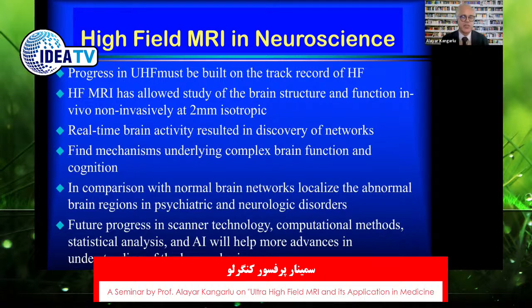For your question regarding multiple sclerosis, as you go to higher resolution, and you saw those cortical gray matter lesions, they have been invisible so far in 1.5 tesla MRI, which is the bread and butter of all the neurology and radiology departments.